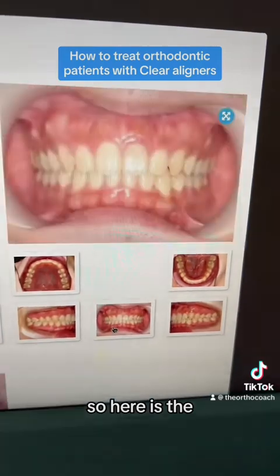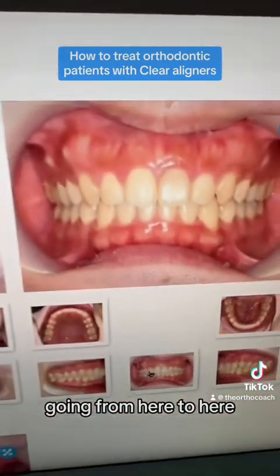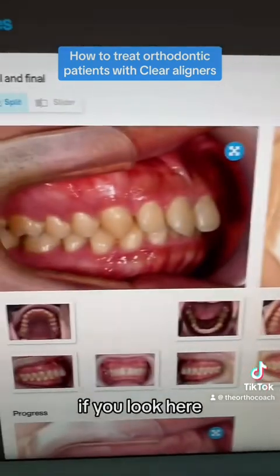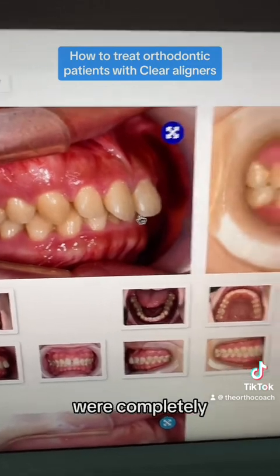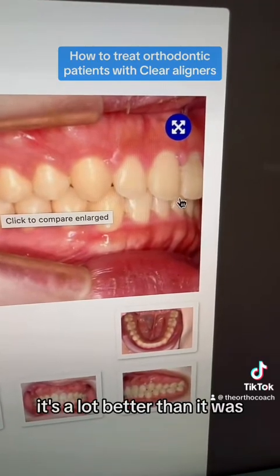So here's the finished picture. They actually did a super nice job correcting the deep bite. If you look here, going from here to here, that looks very nice. They also did a very good job correcting the deep bite from the side view. If you look here, with the patient, you couldn't even see the lower teeth at all. The upper teeth were completely overlapping them, and now they still have a little bit of a deep bite, but I think it's a lot better than it was.